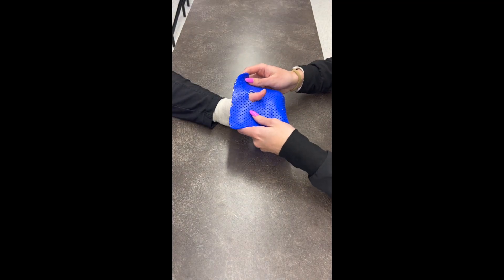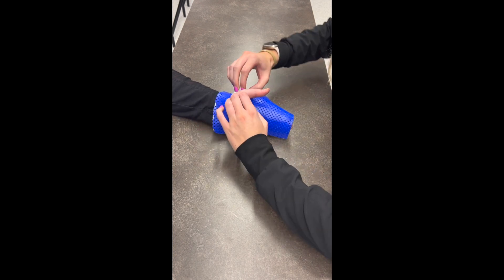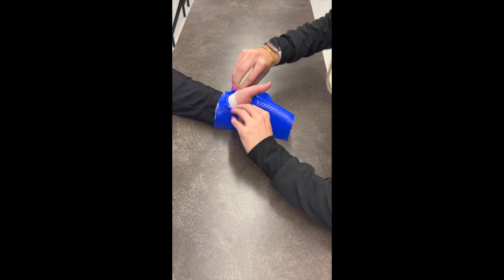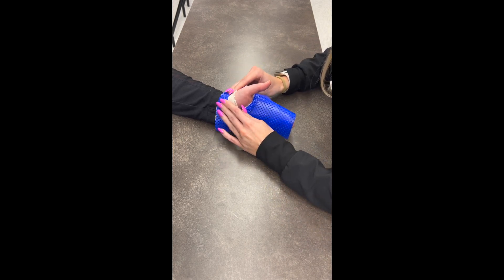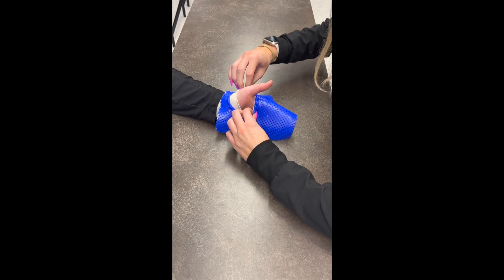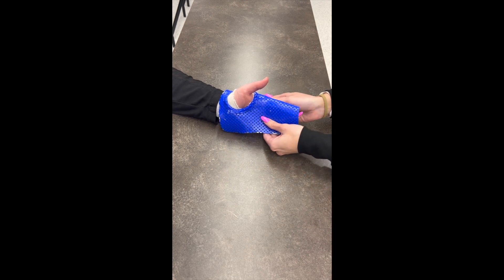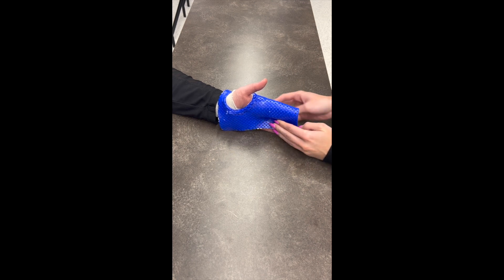When your materials are ready, you're first going to fabricate it around the thumb. You want to roll it out far enough so that you're not limiting any motion of the thumb. Then you can tack the material around the fingers — for this one, we're just doing the index and middle finger.